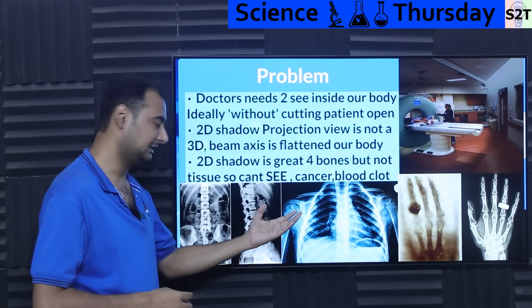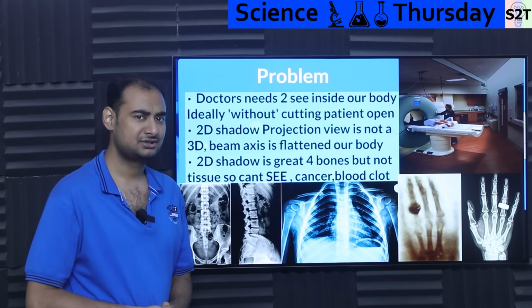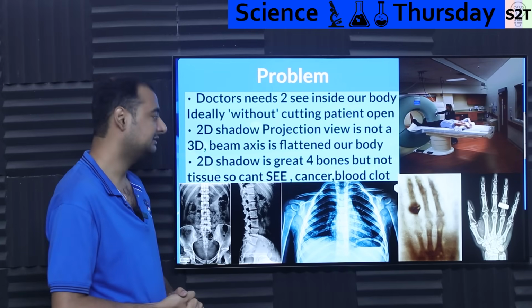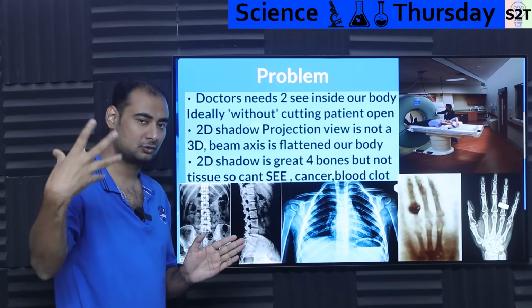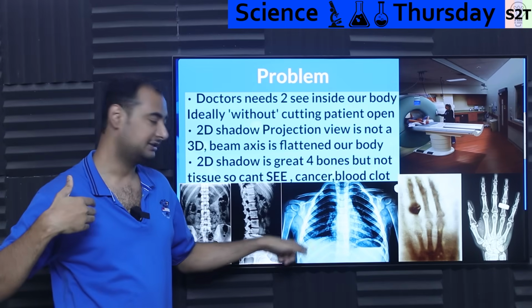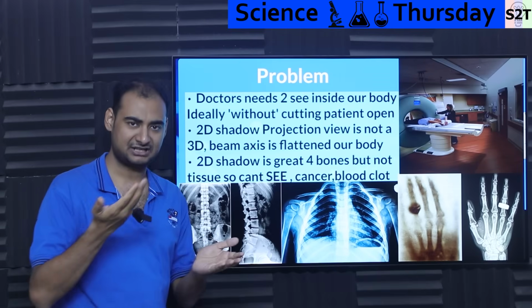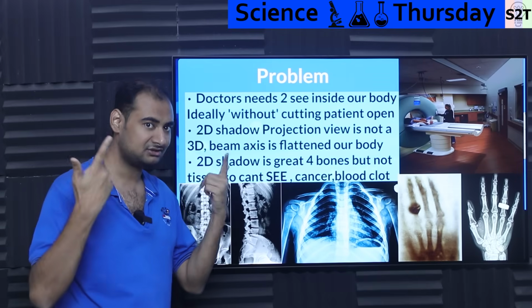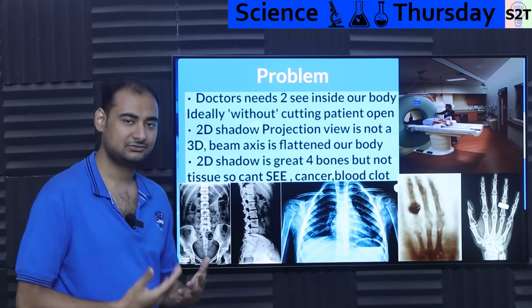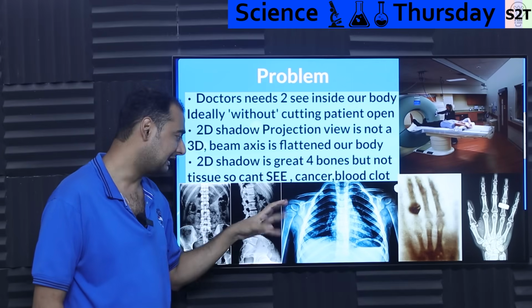Whenever you see X-ray images, specifically the side and front profile, it gives you the illusion that it's 3D. It's not. Mathematically, this is a compressed data point: light is coming from the axis of photon emission, and I get a chest X-ray like this, where the data is compressed. You do not know which bone is where. Of course, there will be some shadow characteristics, and psychologically the bone is supposed to go like this. So this is good for bones. Anything else, you can have some idea.